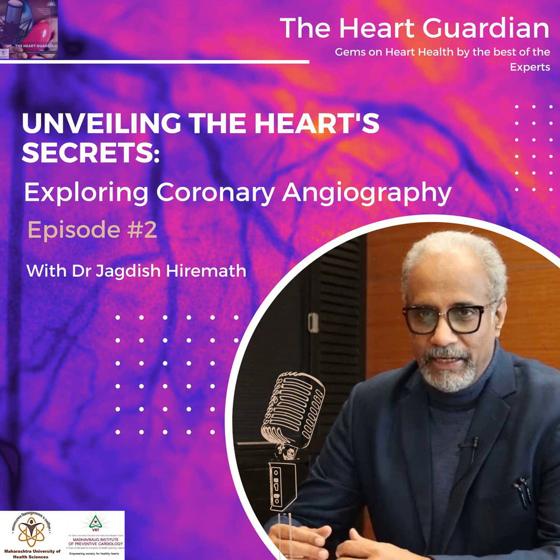Angiography of coronaries is almost 60 years old technique and now it's absolutely refined and practically perfected. Less than 3% complications can take place. At the site where the puncture is made, there could be a little swelling or pain or bleeding. Contrast medium can sometimes cause allergies, sometimes can affect the kidneys. But by and large, it's a very safe procedure.